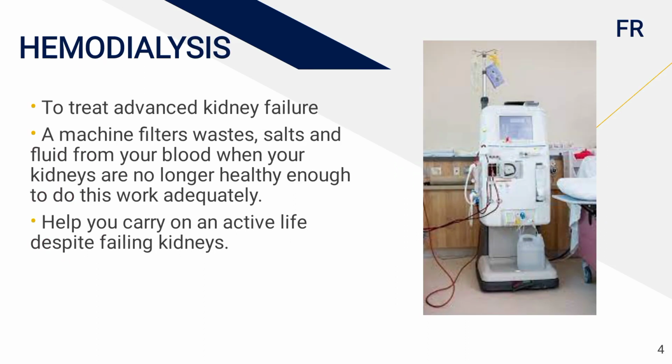And what if a kidney fails? That's where comes our hero, the hemodialysis. When your kidney fails, in the sense it cannot filter, it cannot maintain the acid base balance and cannot maintain the pH level in our body. So at those times, your kidney needs to be replaced.